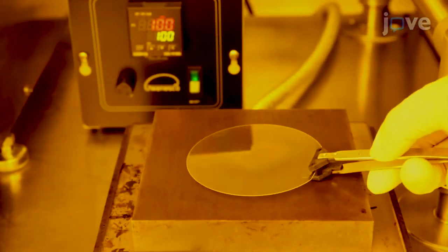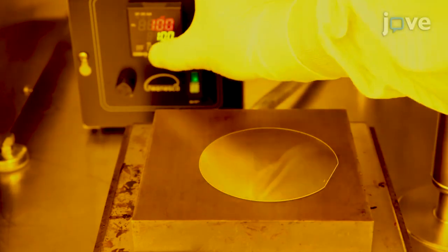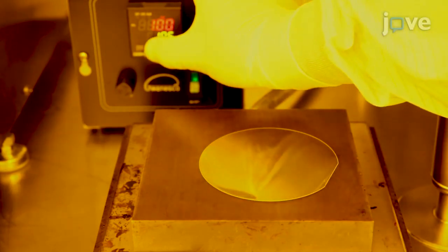Bake the wafer by placing it on a hot plate at 100 degrees Celsius. Increase the hot plate temperature to 150 degrees Celsius, and maintain that temperature for 1 minute.